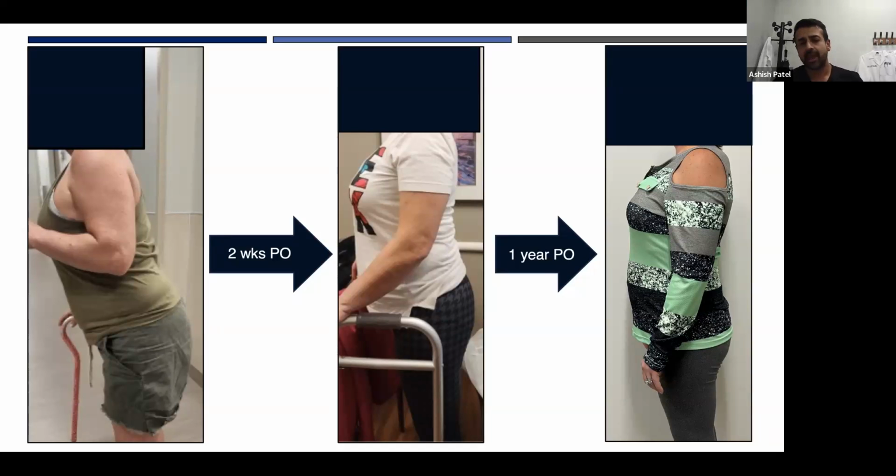Yeah, and really the case highlights, I mean, we were talking through the learning curve and degenerative disease, and that's really the main application when you consider prone. When you consider deformity surgery or multi-level surgery, you've got to do what feels comfortable for you. And if you're doing a 3-level, when you consider the flip, for some people, the flip is 15 minutes. For some people, the flip is an hour. And so when you consider a 3-level, the percentage of time savings is reduced.